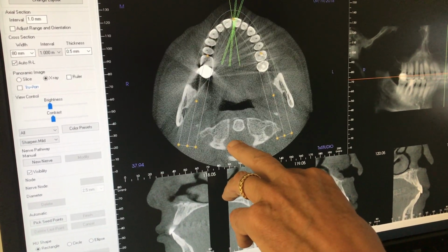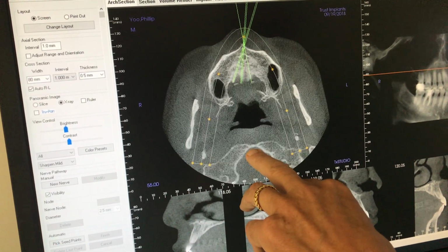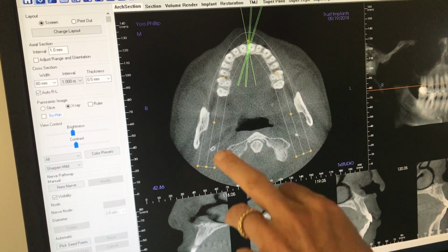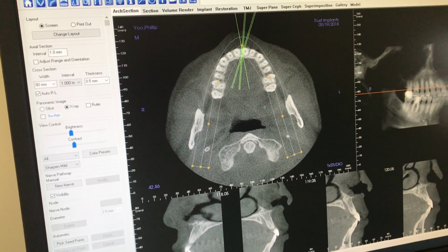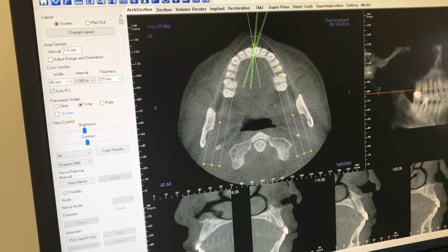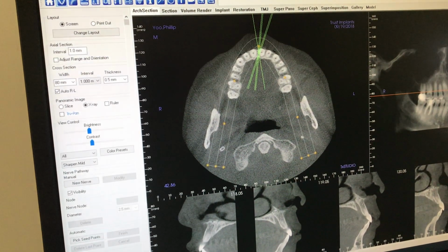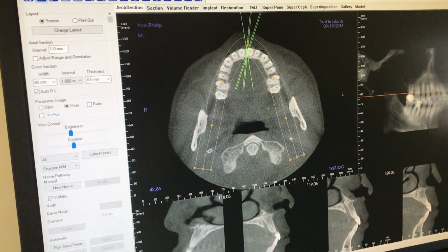I mean, you don't have any images that are this good. No way. Okay, and that's just top to bottom. We can go front to back and side to side also. And you can see the facets, you can see rotations, you can see all kinds of stuff. So you see we're collaborating. You send them here, I'll get you these, and you can go through them with the patients.